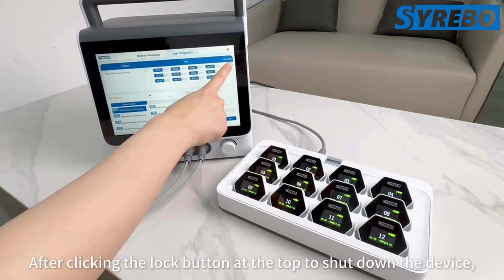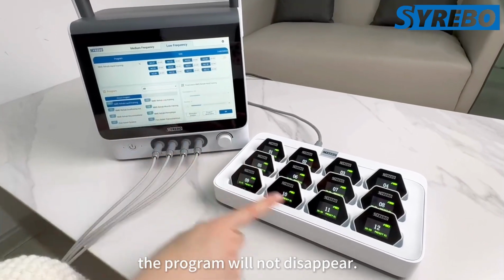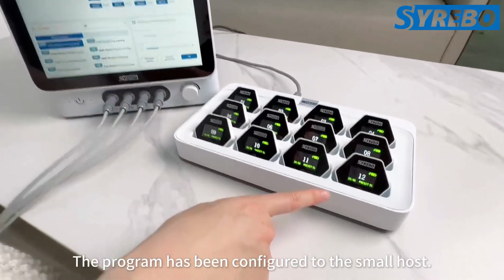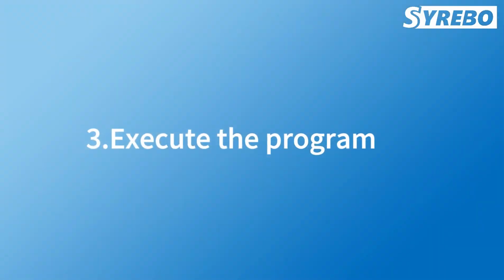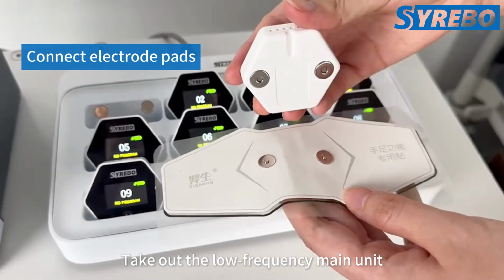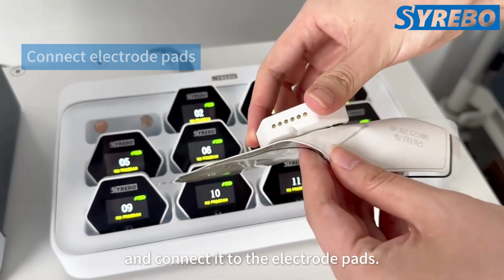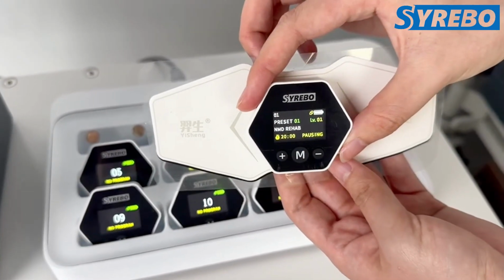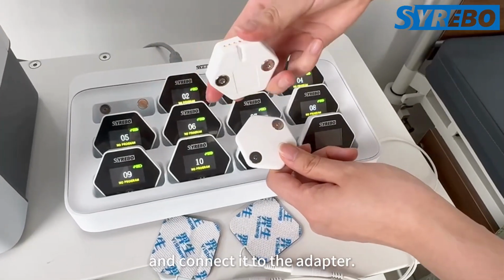After clicking the lock button at the top to shut down the device, the program will not disappear. The program has been configured to the small host. Take out the low-frequency main unit and connect it to the electrode pads. Take out the low-frequency main unit and connect it to the adapter.